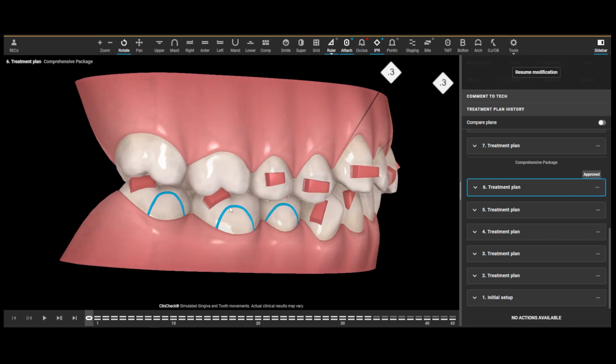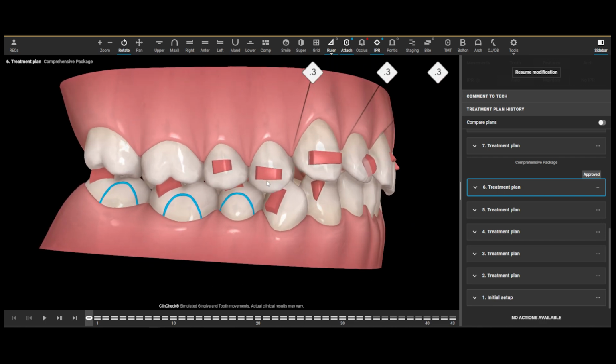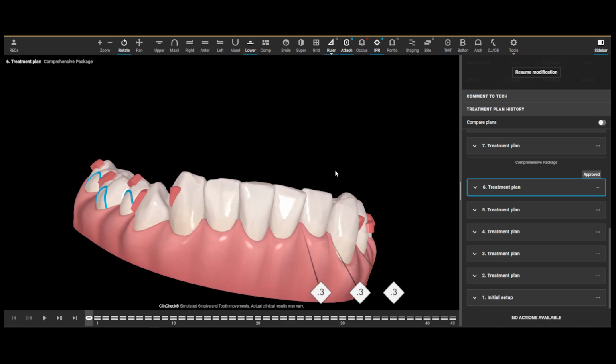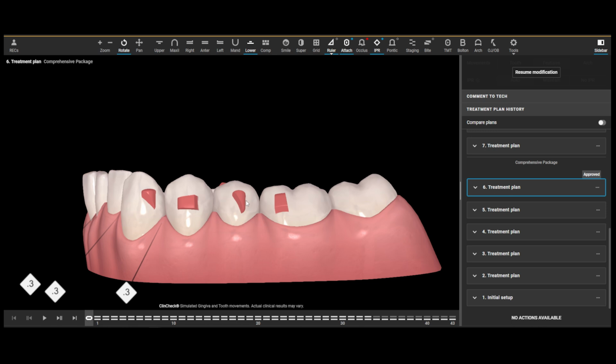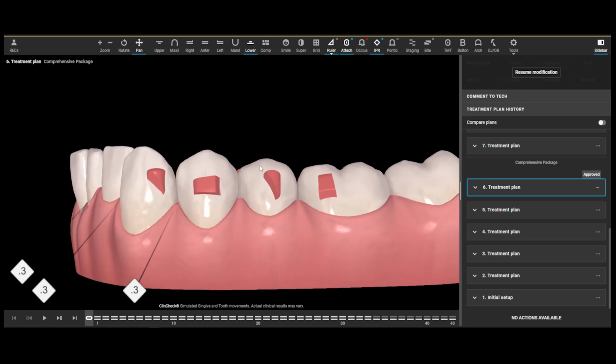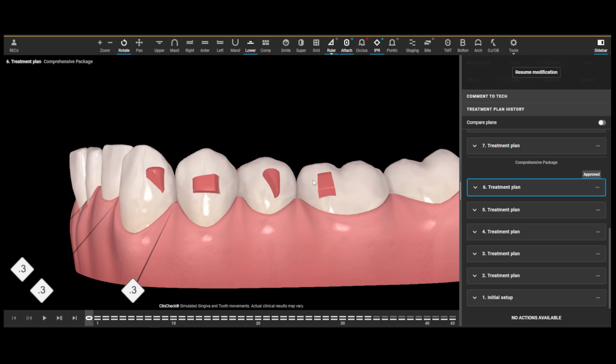So what did I do? I placed my lower buttons. I placed that vertical attachment for the root rotation. I didn't actually change out the attachment here on the second premolar for the deep bite correction. And I actually even left this one as a vertical.